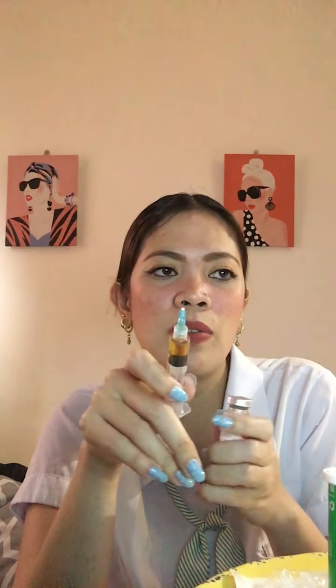And next, carefully insert the needle into the upright vial through the center of the rubber cap, maintaining the sterility of the needle. The center of the seal is thinner and easier to penetrate. Now inject the air into the vial, keeping the bevel of the needle above the surface of the medication. So air must be injected before aspirating. Injecting into the vial's airspace prevents formation of bubbles and inaccuracy in the dose. Now withdraw the prescribed medication.